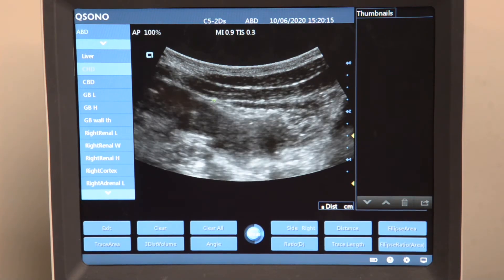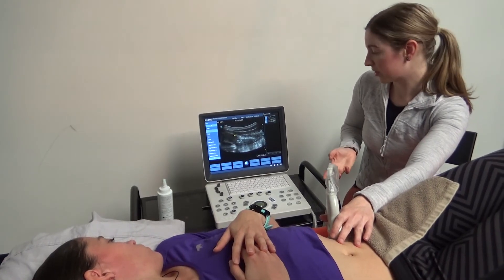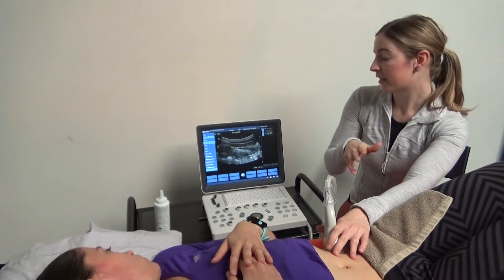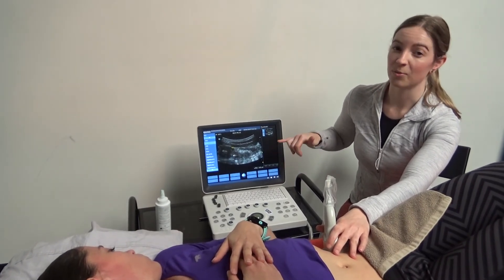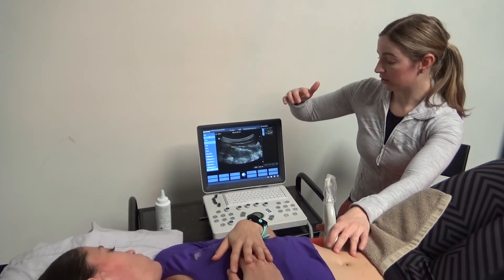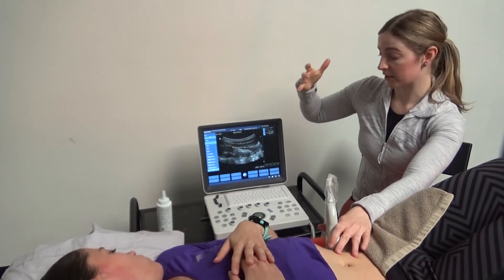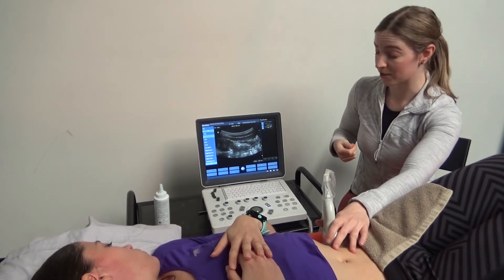We're going to take a measurement of how much glide she has got. This is quite a good contraction — what I usually like to have in terms of contraction is about one centimeter or more. We're only looking at one attachment here, so we multiply that by four, and that's what you're going to get in terms of tightening of the abdominal contents — about four centimeters, which is quite significant.